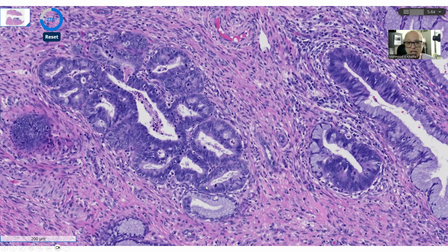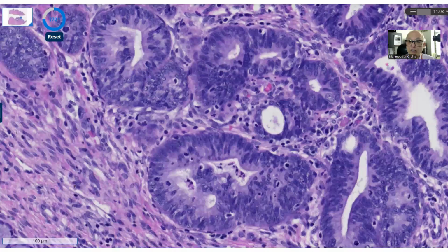I have mitosis, I have apoptosis, and more importantly, I have these nuclei. I want you to spend time looking at these nuclei. They are tall, they are elongated, they are darkly stained. You cannot see chromatin details, because that is the differential diagnosis from endometrial cancer. In endometrial cancer, the nuclei are round, the chromatin is open and coarse, and you can see through. Here you cannot see through because these nuclei are loaded with the viral genome, so they are darkly stained. Here is higher power. You can see the tall nuclei jumping on each other.